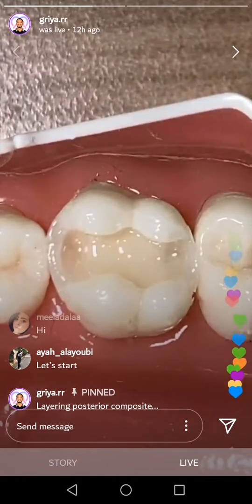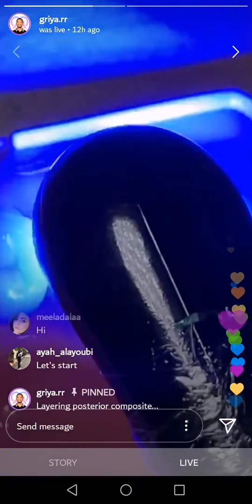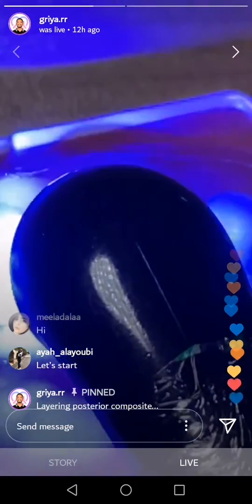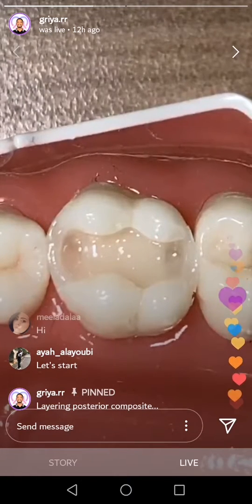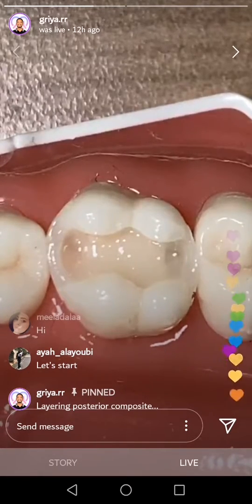So I will use the dentin color. Okay, if you have a deep cavity, so posterior you need to add dentin color. Why dentin color? Because dentin color, it will covering all the discolorization situation. If you have amalgam discolorization, if you have affected dentin with brown color situation that you don't have to prep again, so the answer is using dentin color.